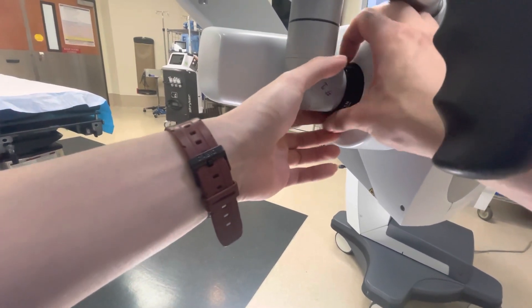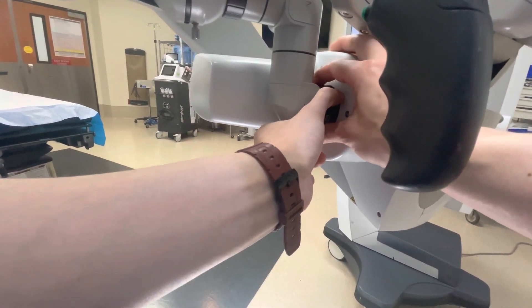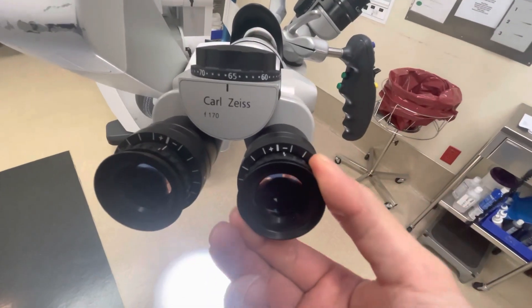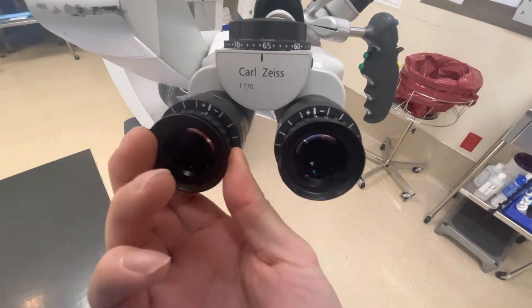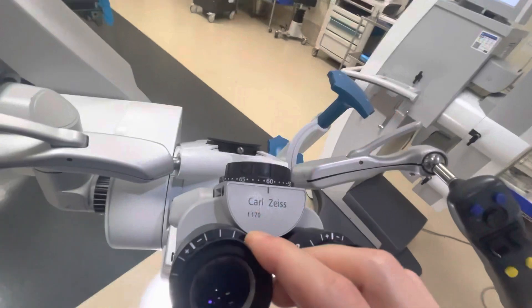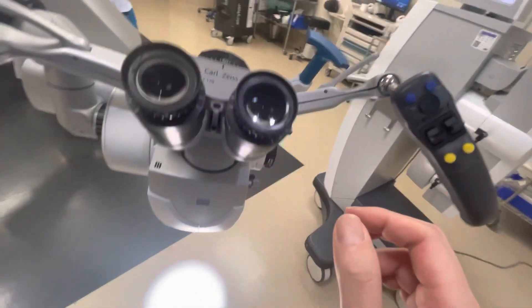Once you have that done, use two hands to make sure it's well seated, because that arm is thousands of dollars — you don't want to be the one that makes it fall. Go ahead and zero these eyepieces. There are lines on the eyepiece itself; do it on the observer port and also for the surgeon. Normally it's zeroed and people don't mess around with it too much.